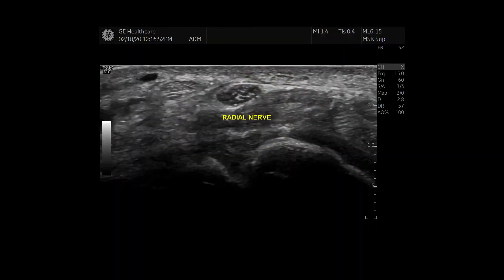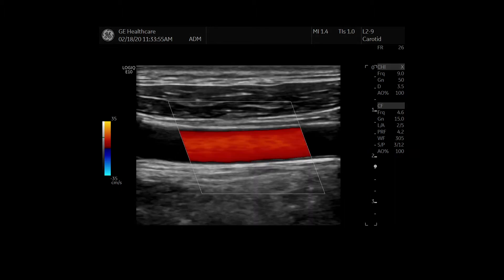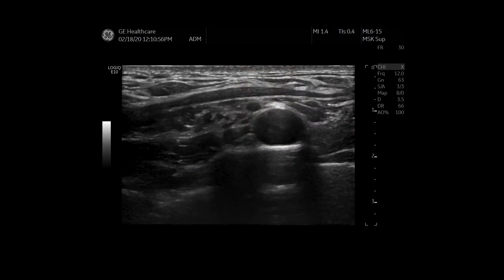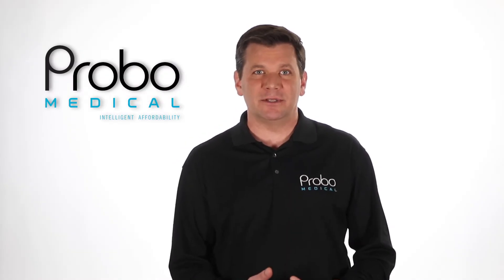The image resolution on the near field and far field were great. Getting a great image was easy — we didn't have to touch the gain or the dynamic range or maps or any of that stuff to try and optimize the image. It just showed up great. Difficult things were easy to view, like a brachial plexus or a thyroid. Little nodules on the thyroid just popped up and there was no work in getting the image.